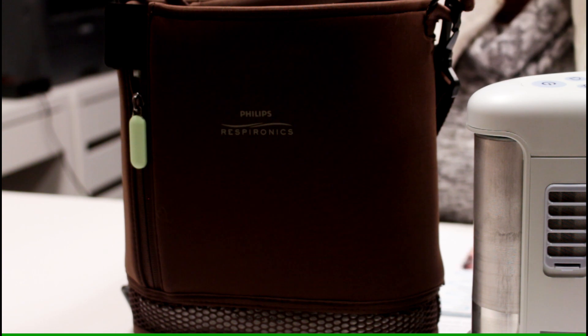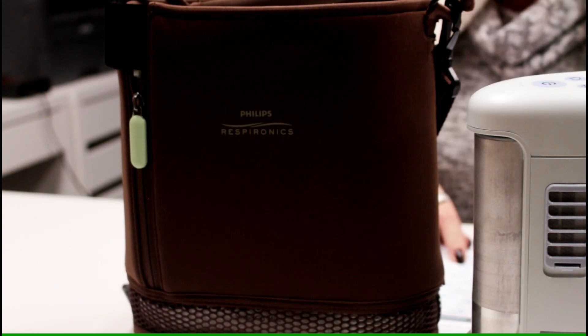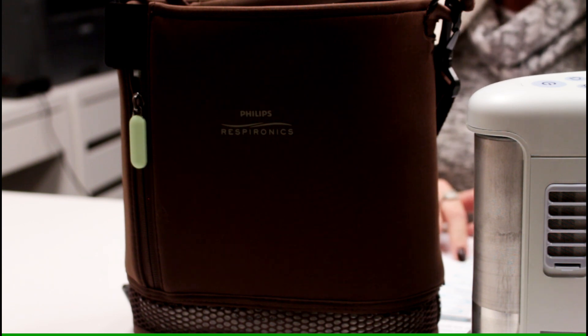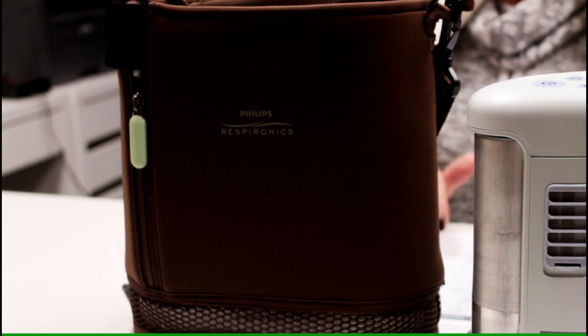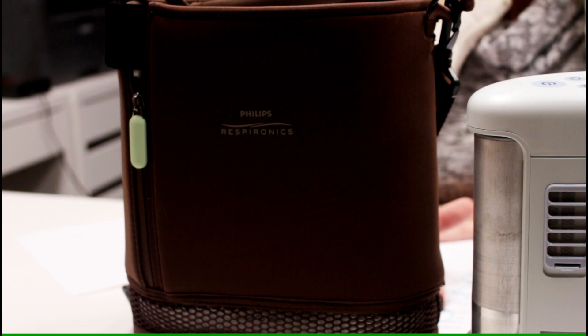The SimplyGo Mini has one battery. At 1 to 2 liters, the battery life is 9 hours. At 3 liters it's 5 hours, at 4 liters it's 4 hours, and at 5 liters it's 3 hours. It takes between 4 and 8 hours to recharge the battery, and it is FAA approved.